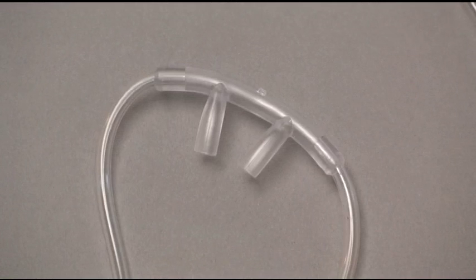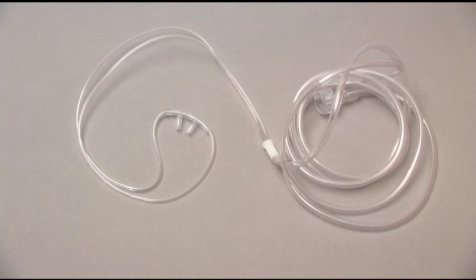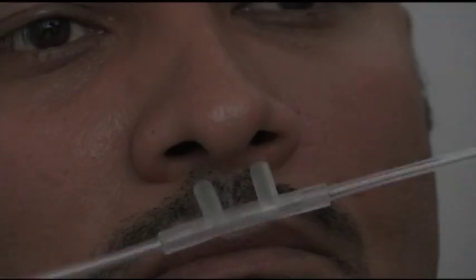Oxygen is delivered to the patient by two soft plastic tips, commonly referred to as nasal prongs, that are connected by thin tubing to the main oxygen source. The prongs rest a short distance inside the patient's nostrils.